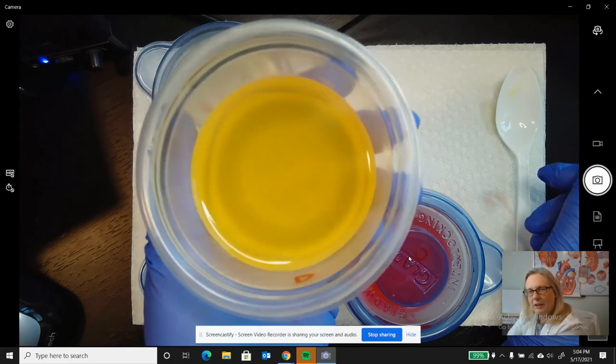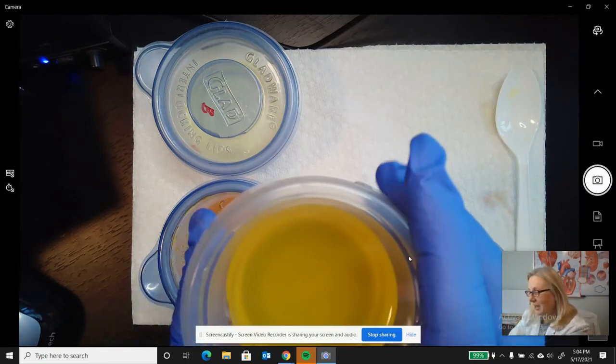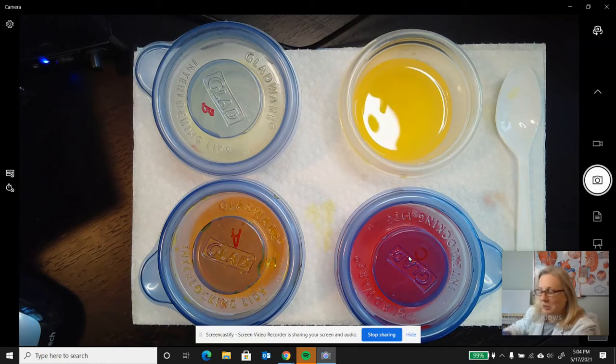And now for the smell. Here we go. Oh, this one smells really bad, actually. This is an awful smell. That's a strong smell. Ew. Lucky me, you guys don't have to do this. It's okay. It's cool. I'll take one for the team.